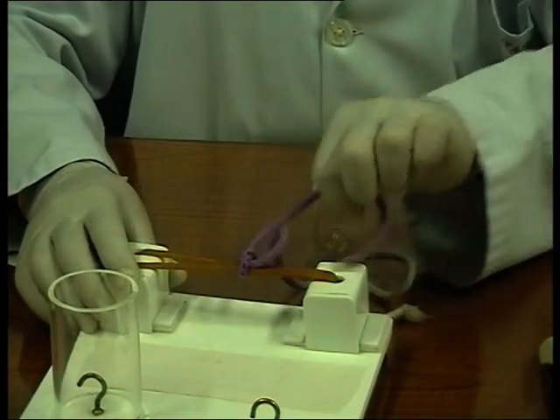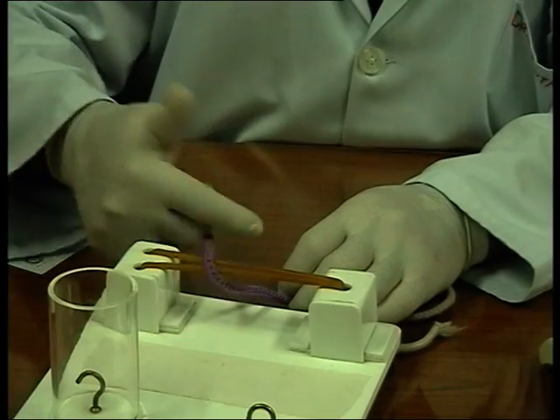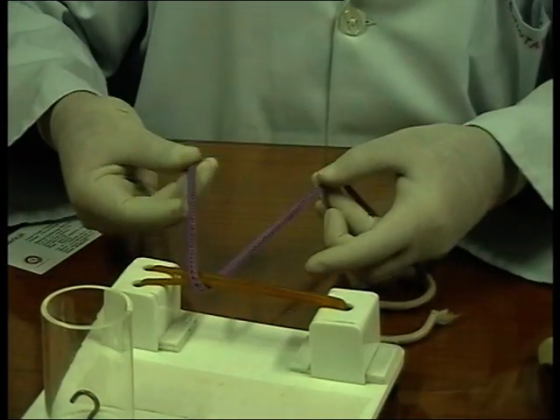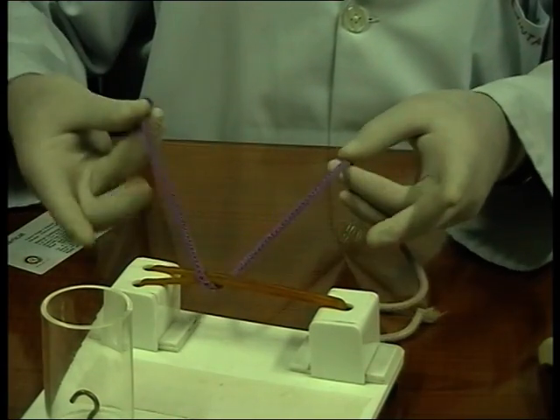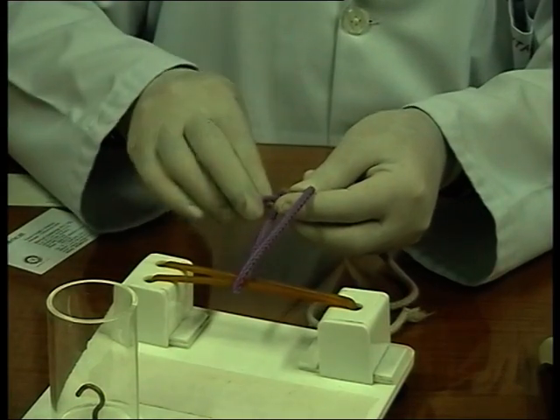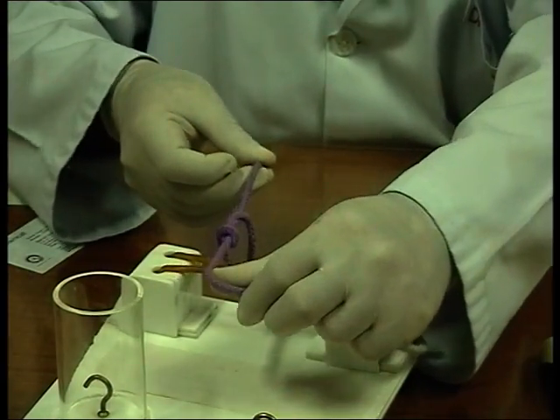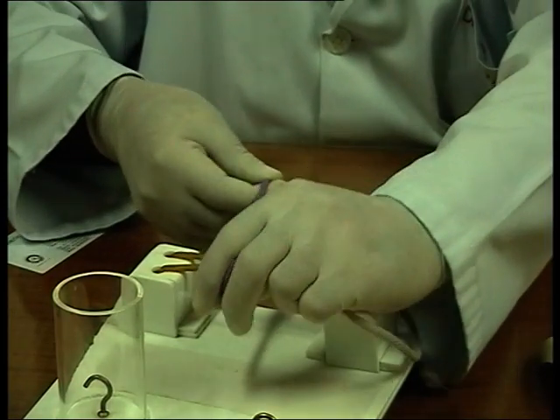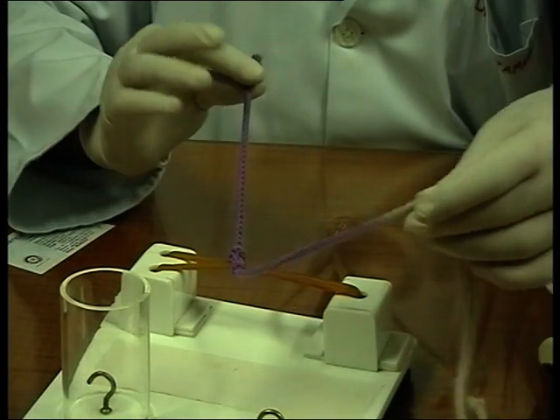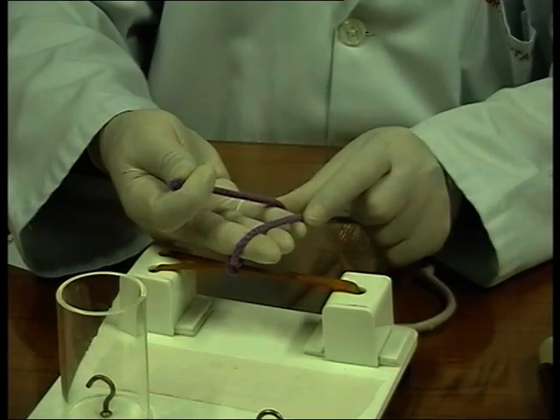The second knot which you must know is a surgeon's knot, done in situations where the tissue has a tendency to spring open or spring apart, or the tissue has a memory. We take the short end which is away, long end is towards me, again an index finger throw, hold the section, take out once and then twice, and these 2 pulleys help me in ensuring that my throw doesn't slip. The short end is towards me, long end is away. I hold it like a dart, wrap it around my 3 fingers, bring the other one right across.